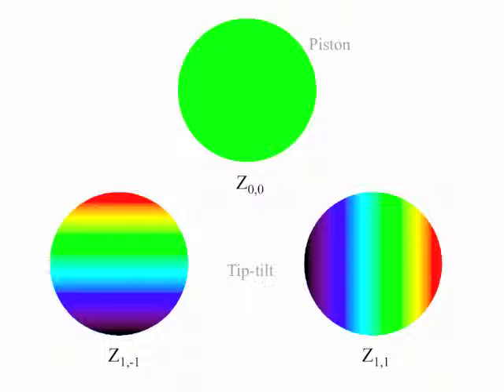Not important clinically. Similarly, if we were to take the entire wavefront and just tilt it, it's an absolutely perfectly planar wavefront, but we're tilting it, then that is called tip or tilt, and that's written as Z subscript 1. Again, not something that's relevant to us clinically.